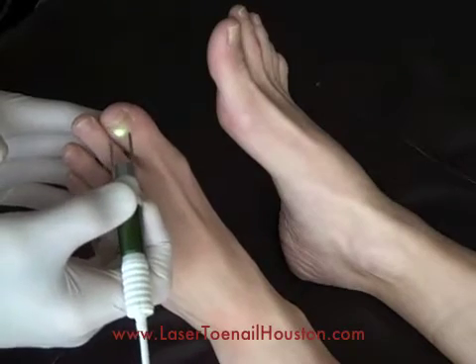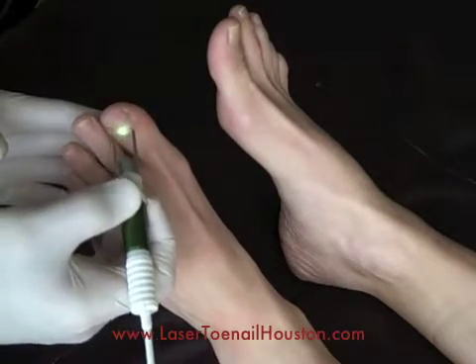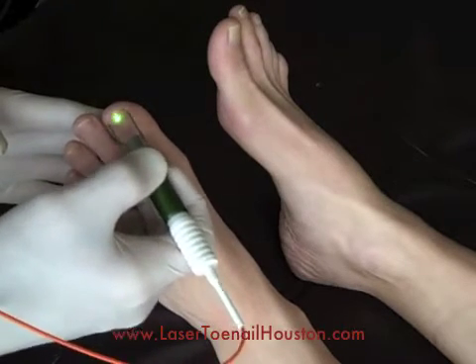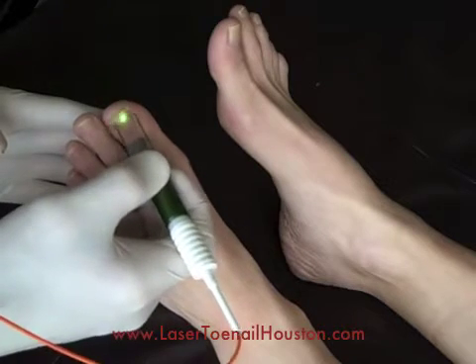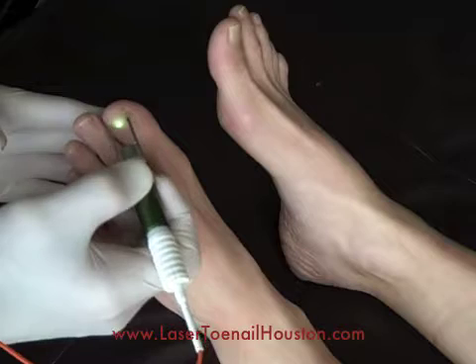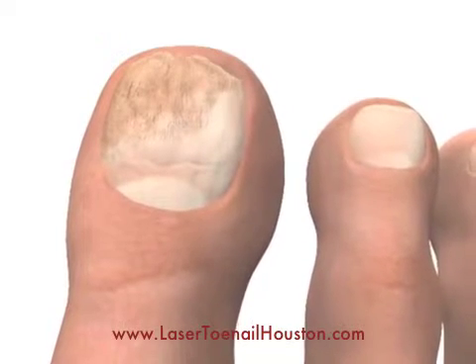Here you can see the laser moving back and forth across the surface of the toenail during an actual toenail fungus removal treatment. All you really notice during the procedure is a little bit of warmth that might be generated as the laser kills the fungus. But after the procedure is over, there is really no change in the appearance of the toenail at that time.